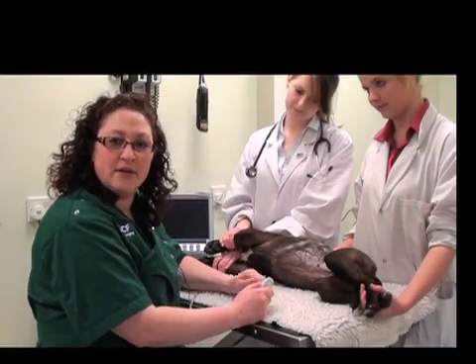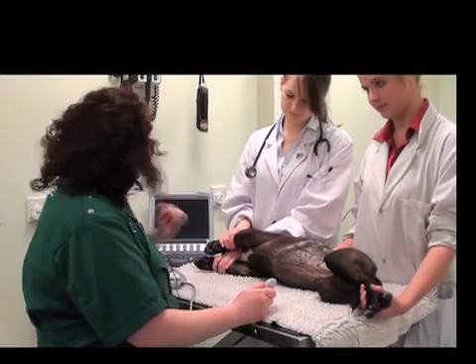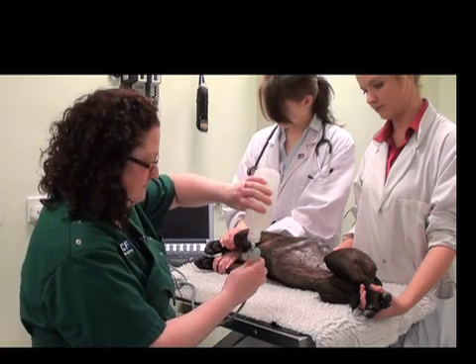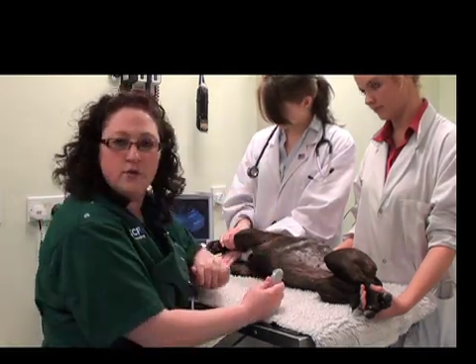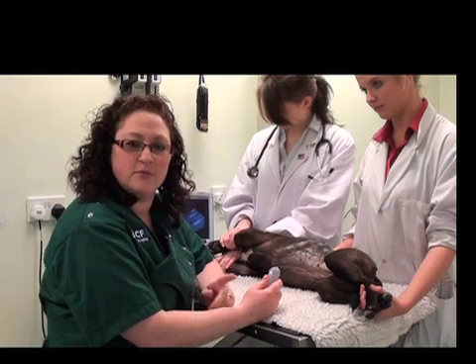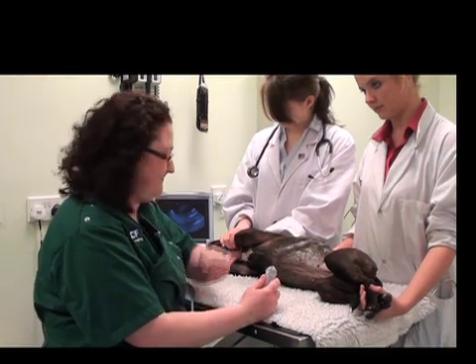Now we'll perform an examination of the GI tract, starting at the stomach. We've already seen the location of the stomach once before when we were looking at the liver, so we'll start there again.